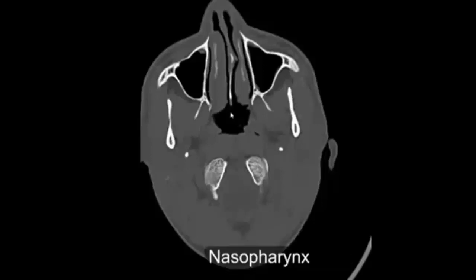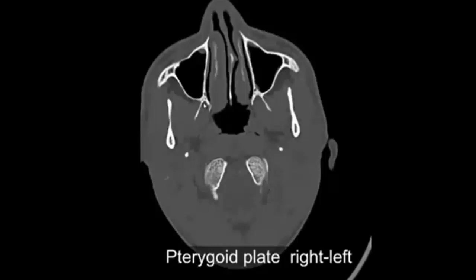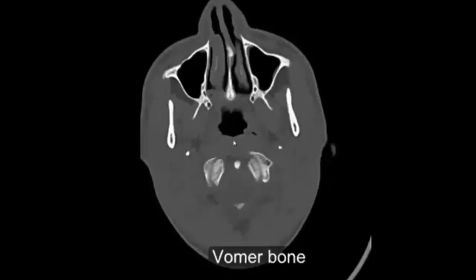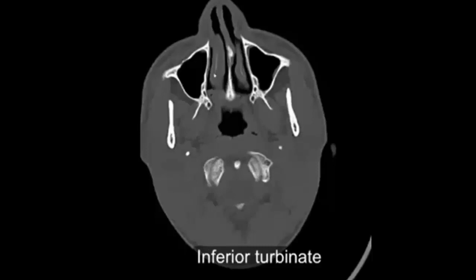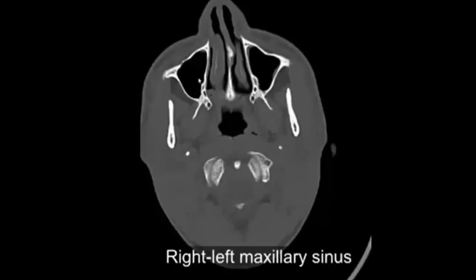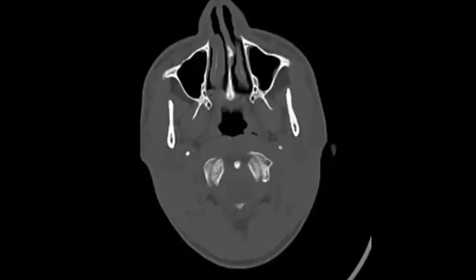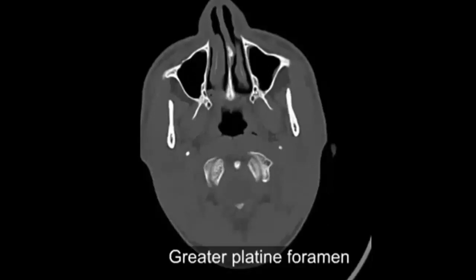Mandible, nasopharynx. Pterygoid plate, right and left. Vomer bone. Atlanto-occipital joint, right and left. Odontoid process. Nasopharynx. Vomer bone. Inferior turbinate, right and left. Maxillary sinus.